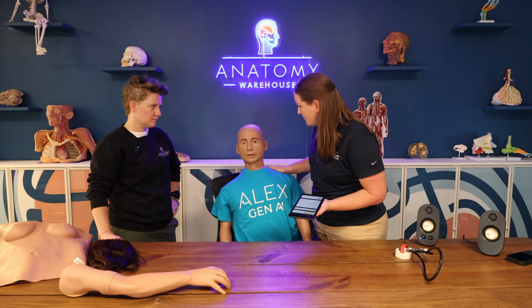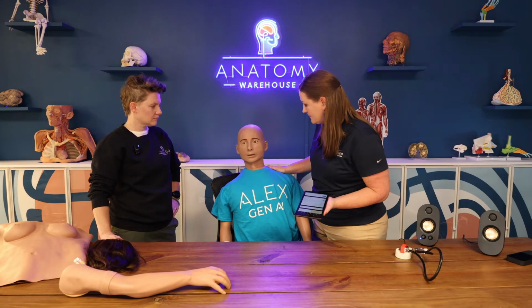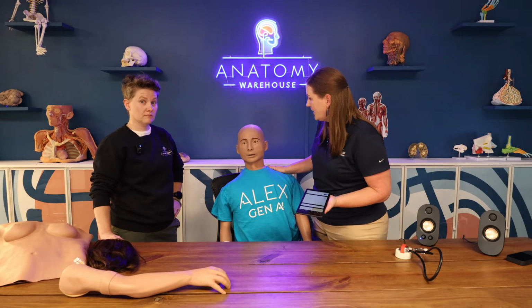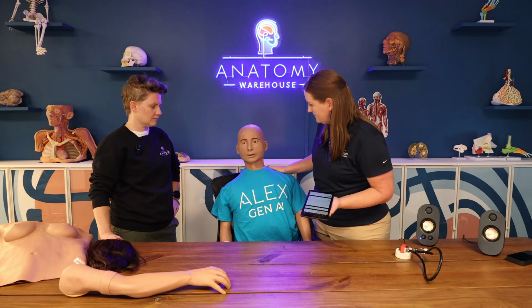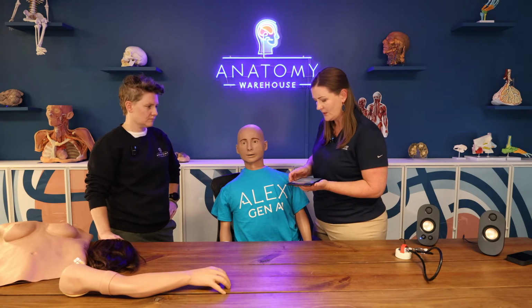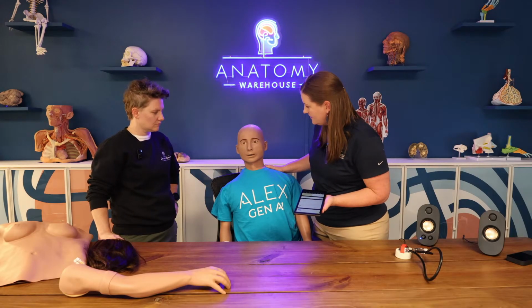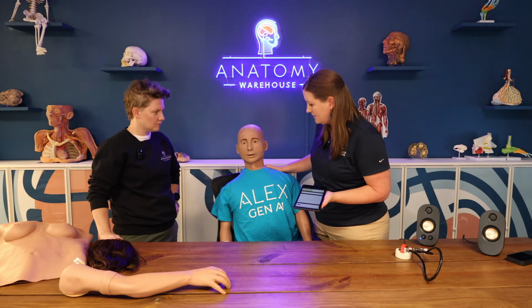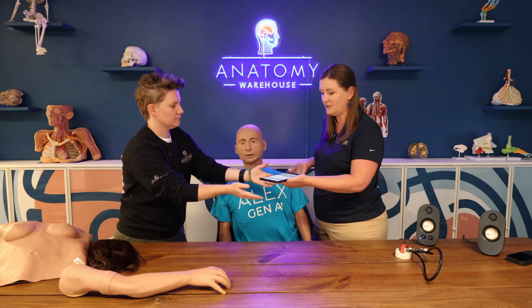Okay. And is there someone that's coming that we can call to come help you from the hospital today? No, I don't think so. I just want to make sure I'm okay before I go back to work. Oh, okay. And is there someone here to transport you? No, I don't think so. I just want to make sure I'm okay before I go back to work. Okay. Andrew, do you mind if I take your vital signs? No, that's fine.